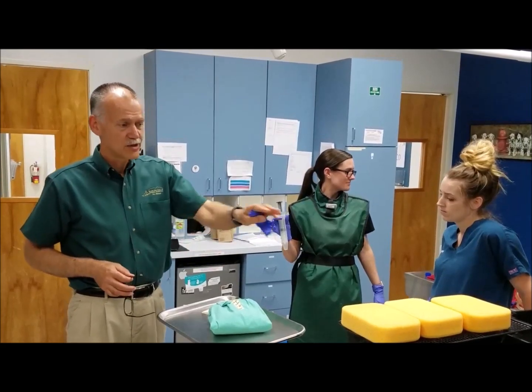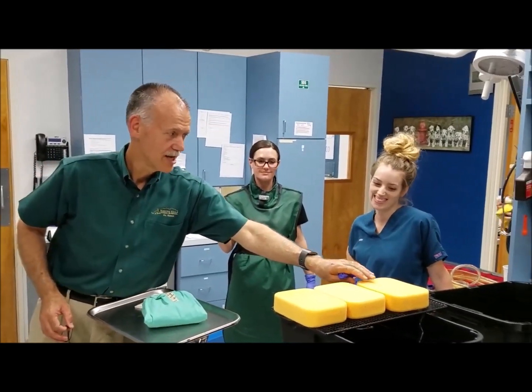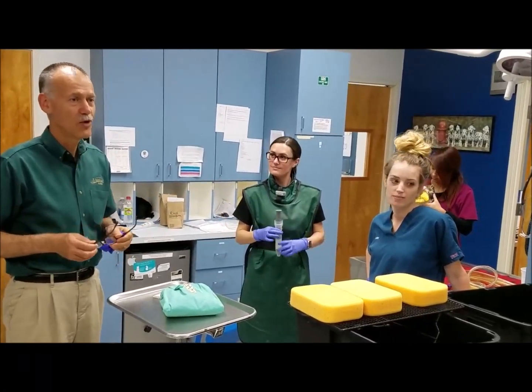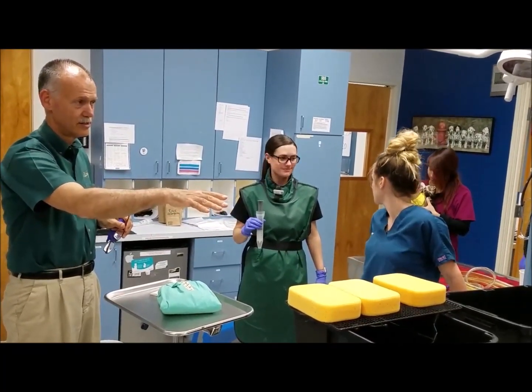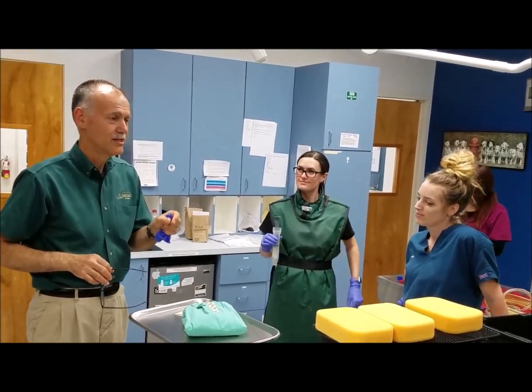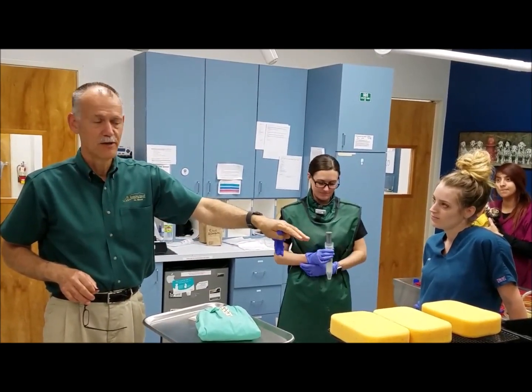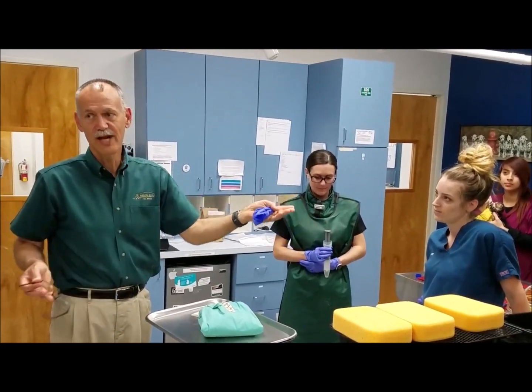Once he's anesthetized, we're going to transfer him to our surgical suite, which is next door to the anesthetic induction chamber, which are these lovely moistened sponges. We're going to cover him with saran wrap to keep him moist, and I'm going to do the surgical procedure right here. To keep him anesthetized in the surgical suite, we're going to have him breathing his tank water with the anesthetic solution.